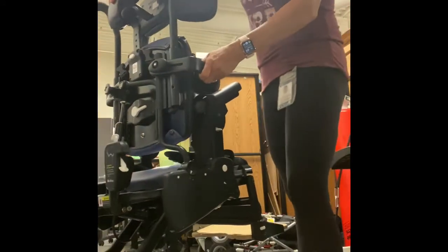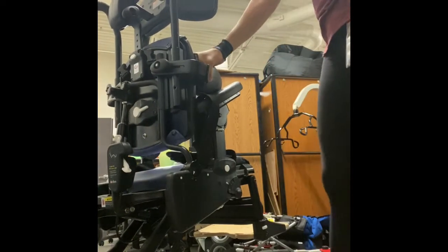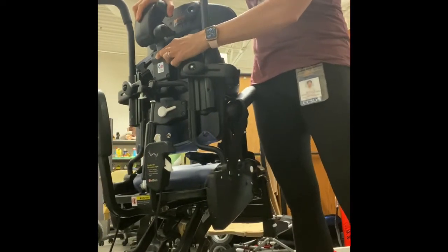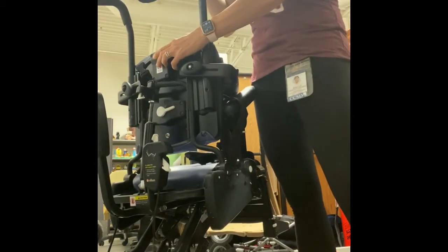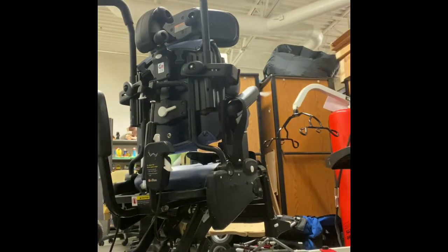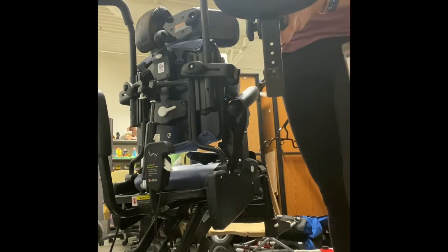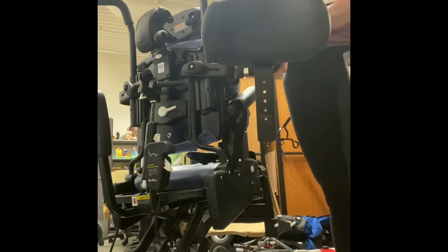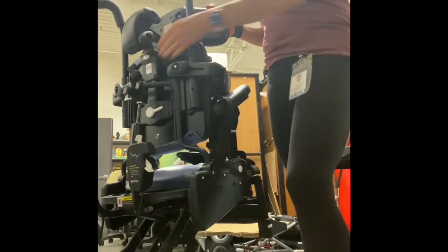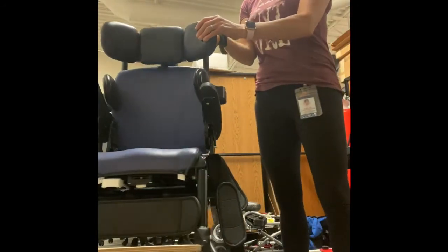Lastly, on the headrest — this one is a multi-panel or tri-panel headrest. It comes up and down by pressing this little knob, and it can actually come completely off. It can be replaced with a flat headrest. For a student that has fine head control, the flat headrest is more than enough. For a student that needs a little bit more side-to-side head control, the tri-planar is one of the best options.